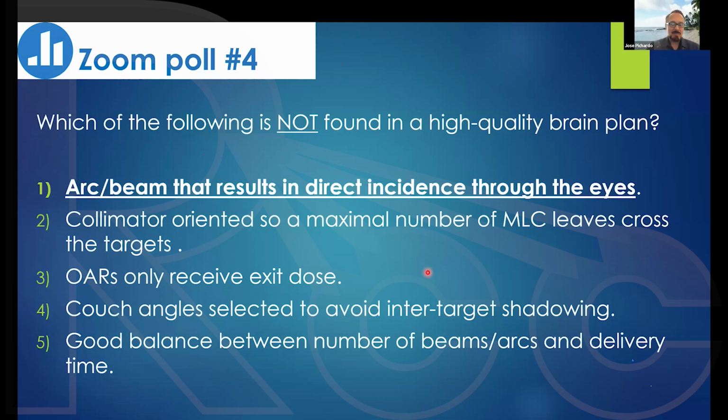Yeah, I've only worked in cones in one of the centers that I worked at. All the other centers were doing Linac based, so yeah. Cones give you a better penumbra, better sharpness of your fields. It has a lot of advantages, and for sure, for something as small as trigeminal neuralgia, I would not feel comfortable treating with anything but cones.